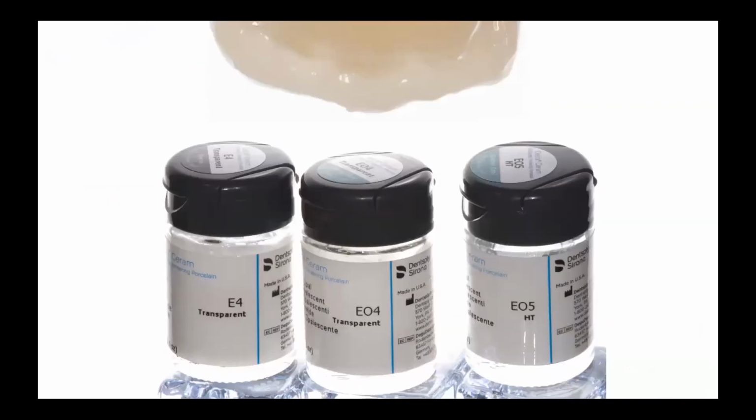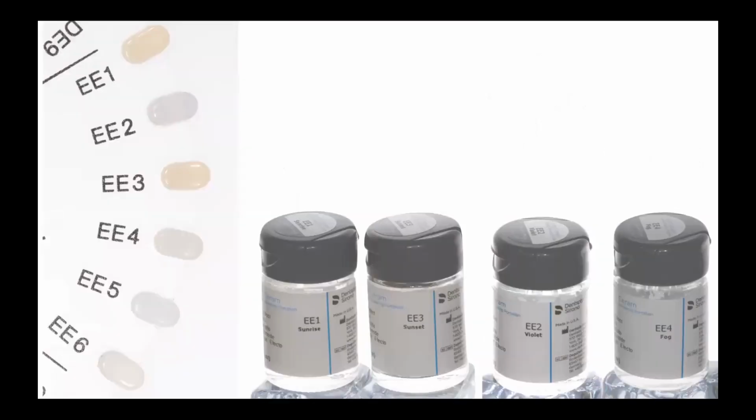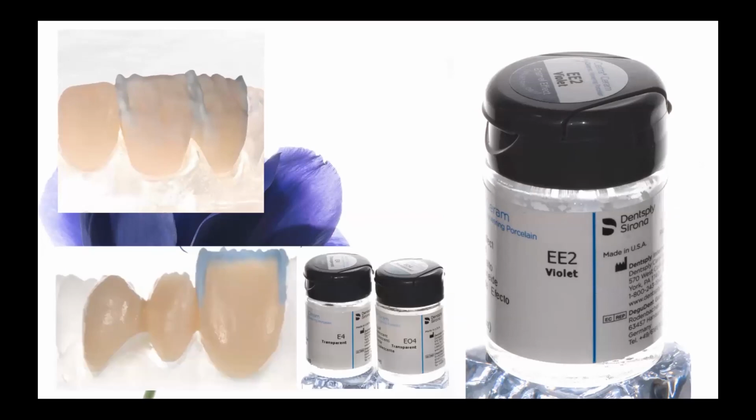And of course, we can emphasize the transparent enamel edge with the help of transparent materials, and transparent materials with increased opalescence. EO4 is my favorite one, and these porcelains can be used to dilute some effects and to reduce their intensity. And the other component I would like to mention is enamel effects. Violet enamel effects are a very aesthetic way when we need to increase the zone of absorption of our enamel layers, especially when we don't have enough room.